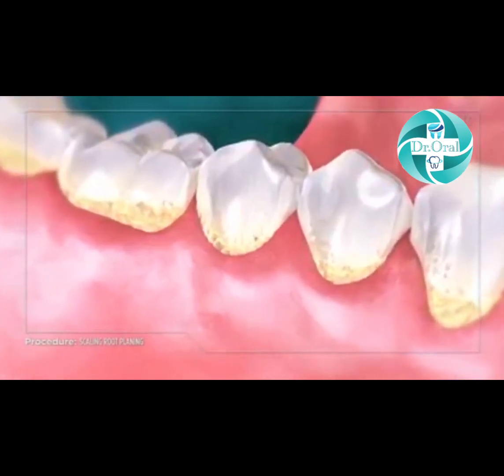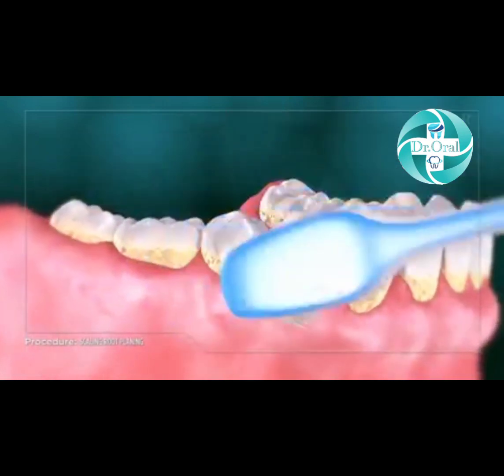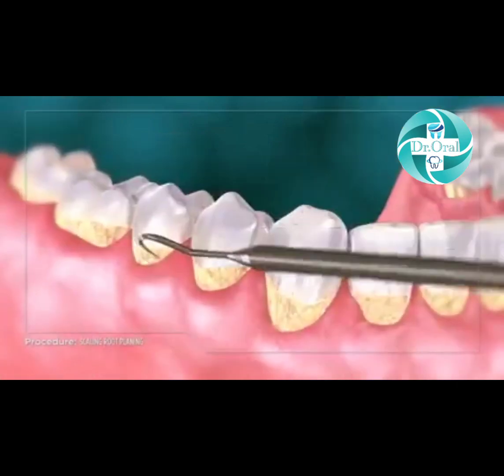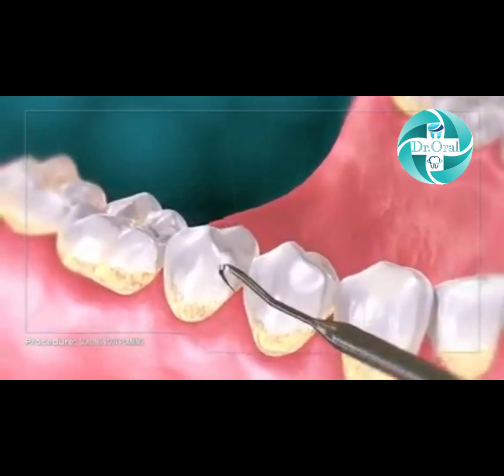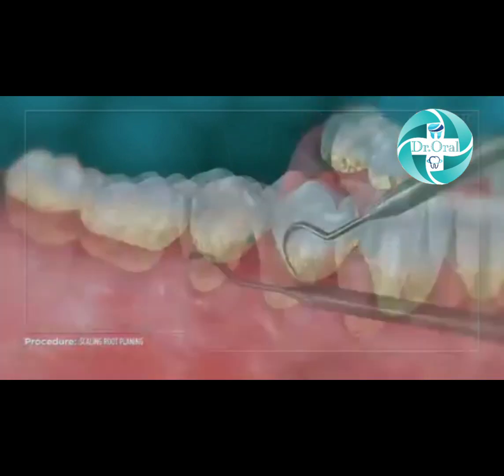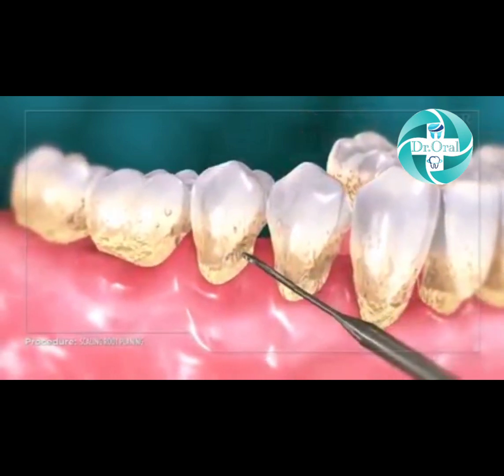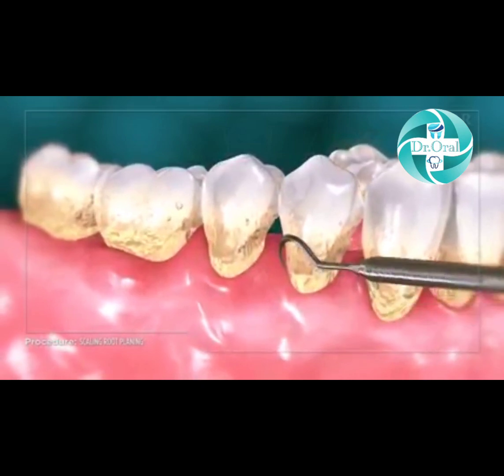Unfortunately, this buildup occurs in areas that can't be taken care of by brushing, flossing, or even a regular dental cleaning. Over time, as periodontitis progresses, it can lead to increased inflammation, bleeding, receding gums, and ultimately receding bone tissue. Your doctor can recommend a procedure called scaling and root planing to remove these deposits from your teeth.